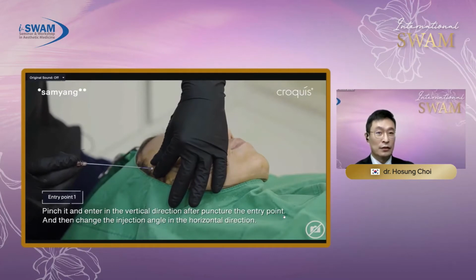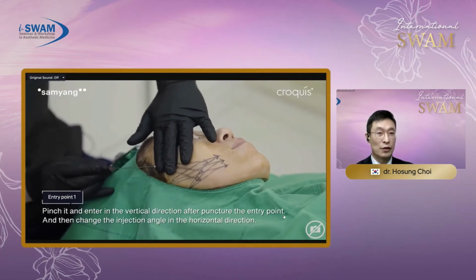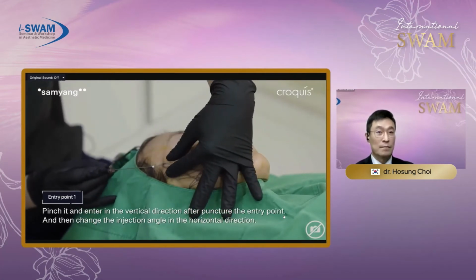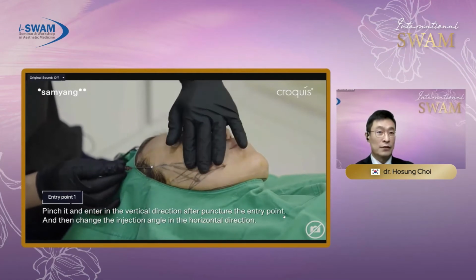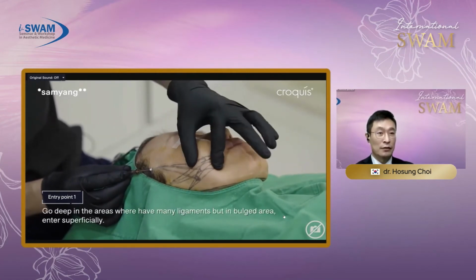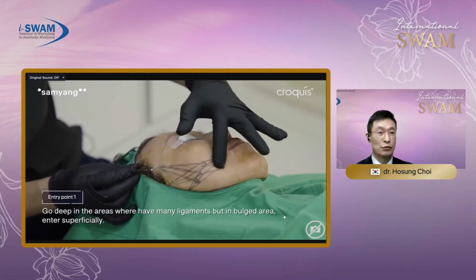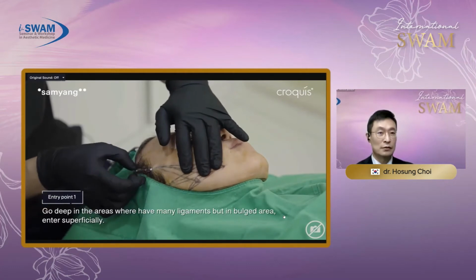When inserting the needle, pinch the skin symmetrically to easily approach into the proper layer, which is a subcutaneous fat layer. And right after the cannula tip passes through the dermis, insert thread almost parallel to the skin surface, which is almost 10 degrees or less.